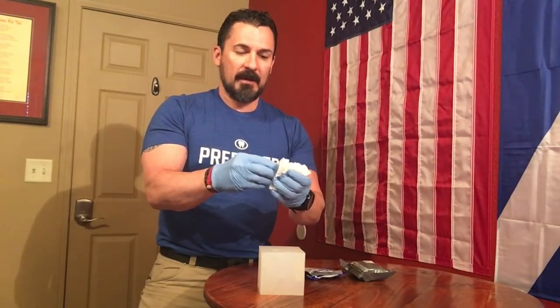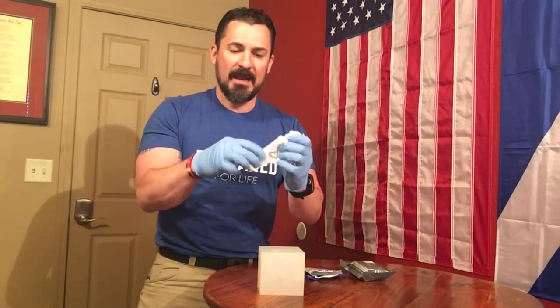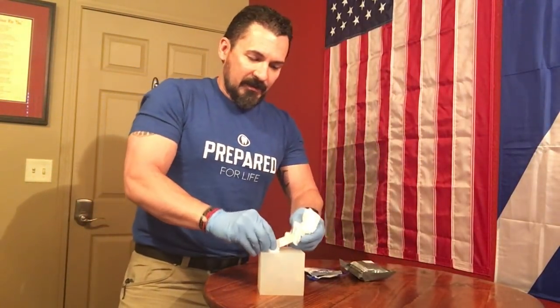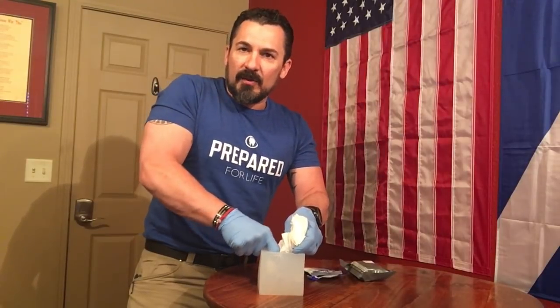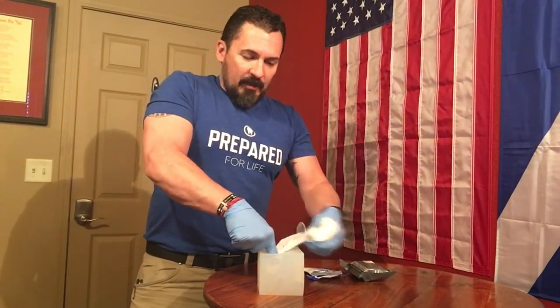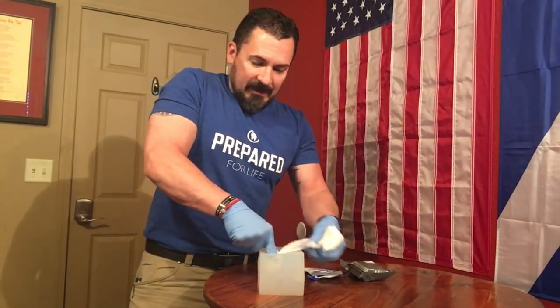During that time, I'm going to go ahead and get my packing material. I'm going to form a nice initial pack, like a little ball. You can see that there, a little wad of it right there. And I'm going to go down into the wound, and I'm going to hold pressure. I'm going to get it down to the source of the bleed. Okay, I'm going to hold pressure on there. Then I'm going to start feeding it in, like a sewing machine method. Just a small amount of gauze, 2 to 3 inches at a time.